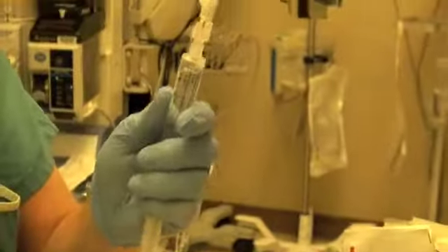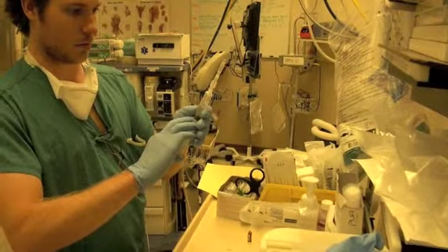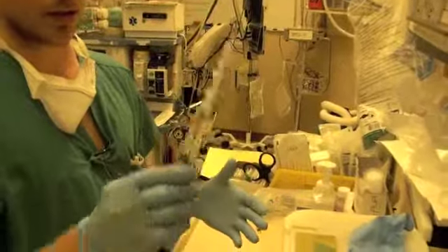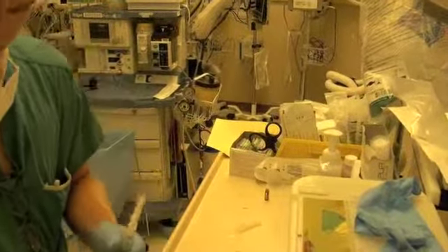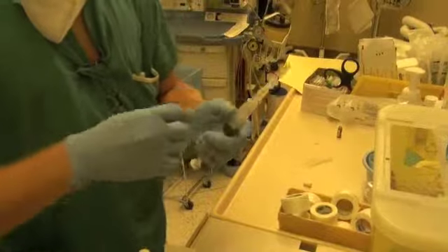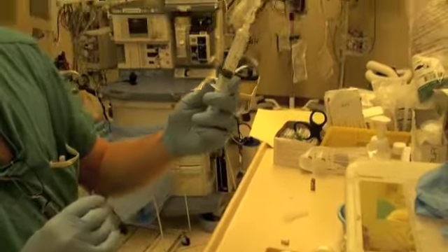And our safety needle slides shut like that, and we just push all the air that we sucked in out, and now we've got a nice, complete, safe syringe of ephedrine here. And the ephedrine's been diluted 1 in 10, so it was 50 milligrams per milliliter. We can label it using one of our labels here. Ephedrine's the purple label, one of the two purple labels.